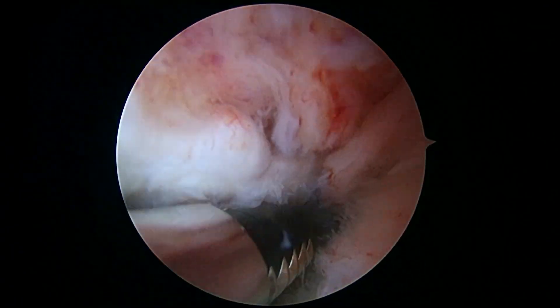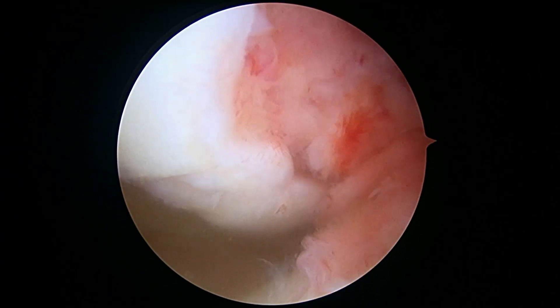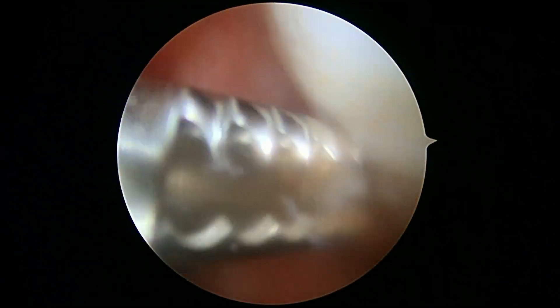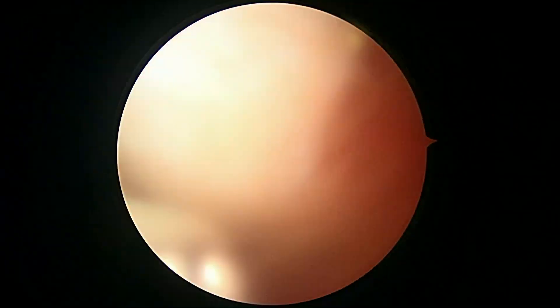Now we're going to look in the central part of the knee. We've got to remove the ligamentum a little bit so we can see better. We didn't really suspect any anterior cruciate ligament problems, so we won't spend a whole lot of time here. That ligamentum is vascular so it bleeds a little bit — that'll stop in a minute.